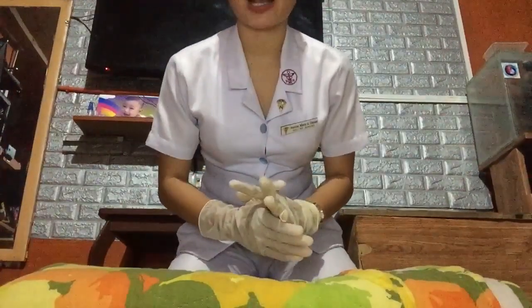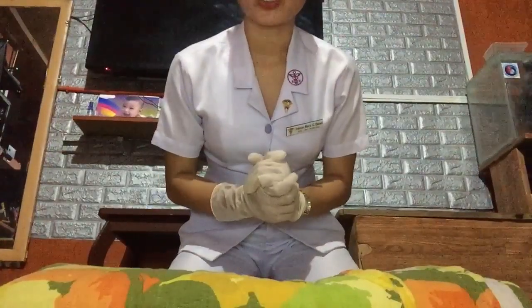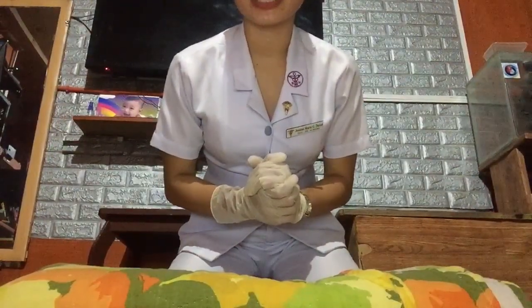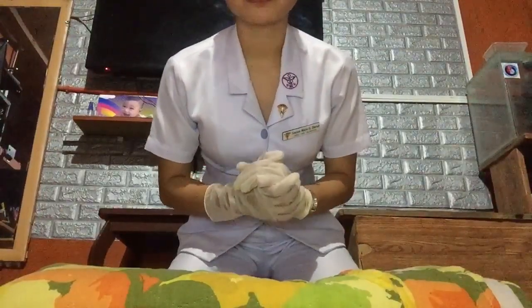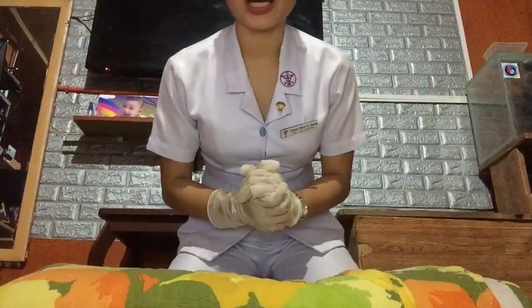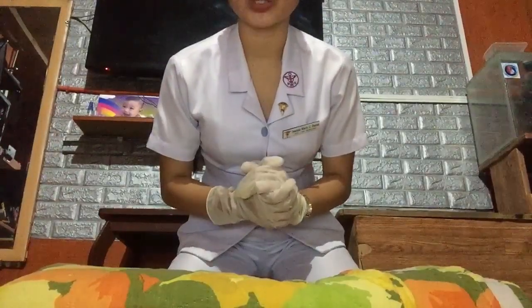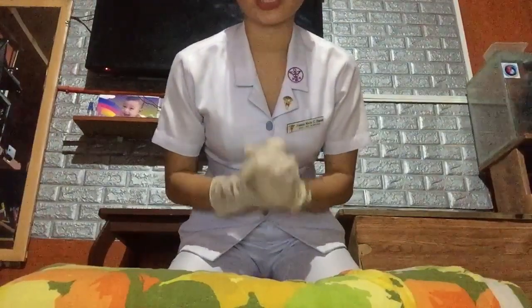So place the pads. One will go over the upper right area of the chest, just below the clavicle, and the other one will be placed beneath the patient's armpit, just below the nipple.